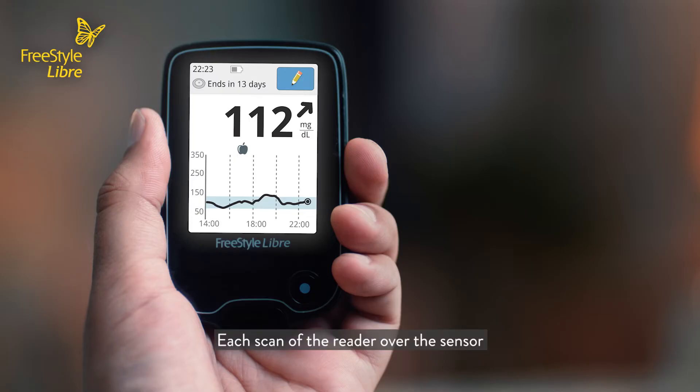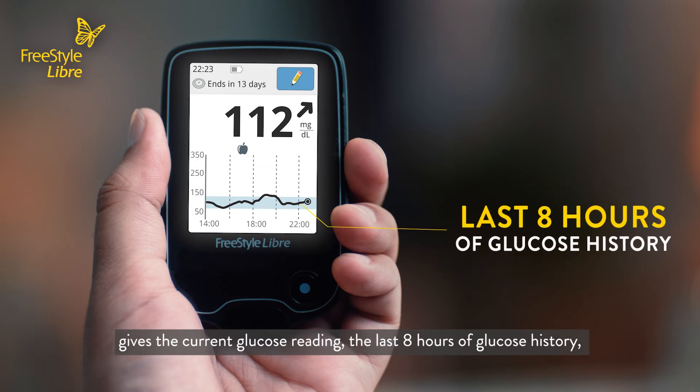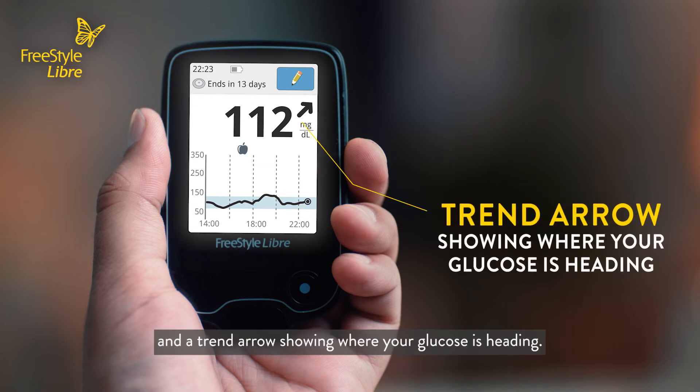Each scan of the reader over the sensor gives the current glucose reading, the last 8 hours of glucose history, and a trend arrow showing where your glucose is heading.